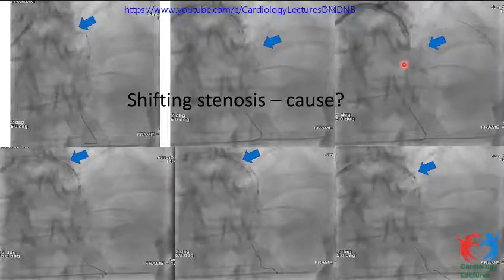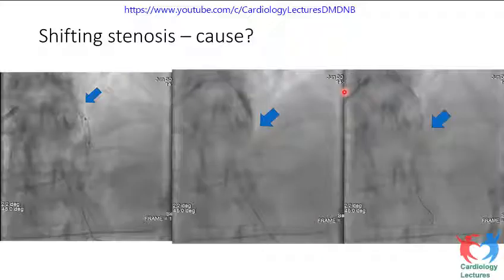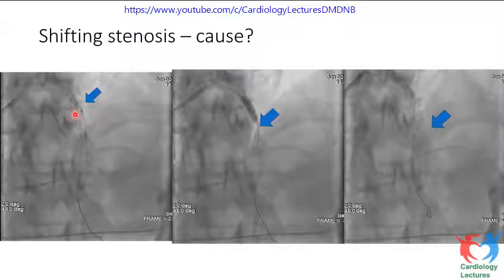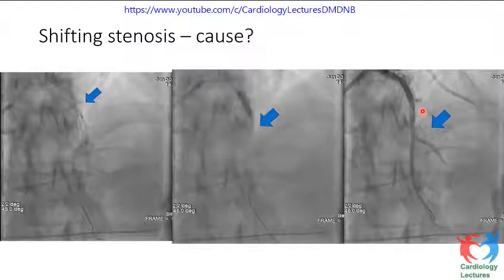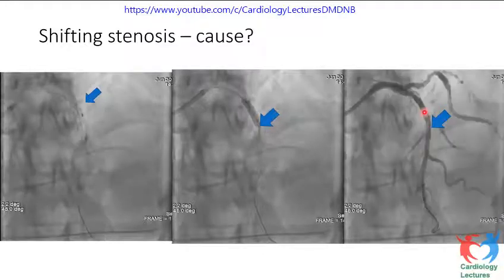We were really puzzled what it could be. So this is what is happening. See here, dilated the distal part, and again the proximal dilated, again the distal becomes narrow here. So this continued to happen twice or thrice. Then I thought we should do some imaging, and then we went ahead with the imaging.